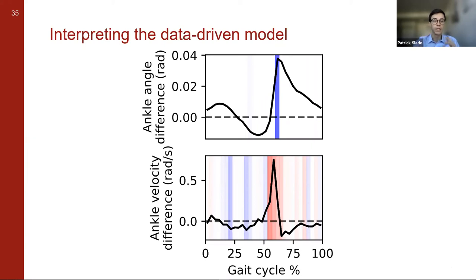So these are sort of competing because you want to push off and have a large range of motion so that you provide good push-off assistance, but you also want to do it slowly to make sure you're not injuring the person, that they're stable. And so the model is sort of balancing these two things, and the way in which it balances it seems to be very accurate for selecting parameters for different users.